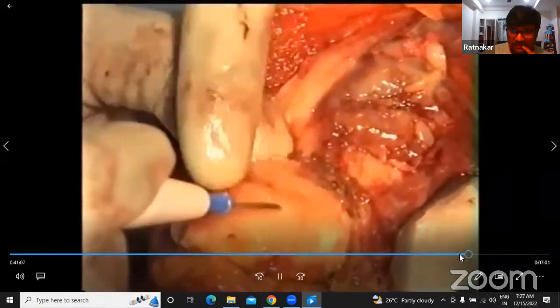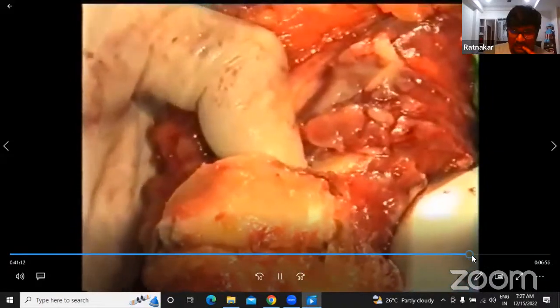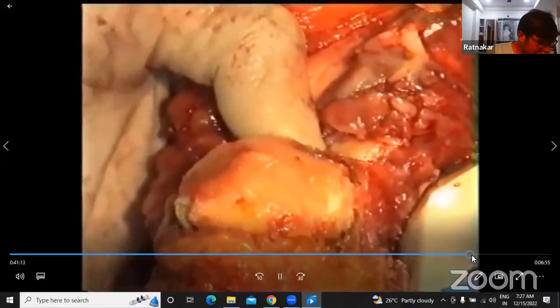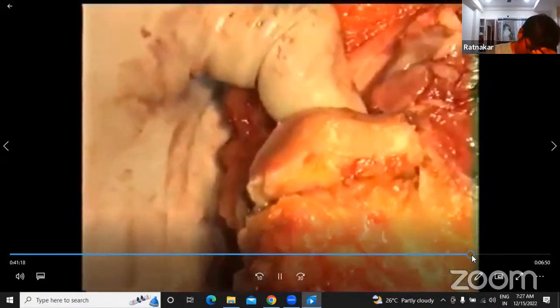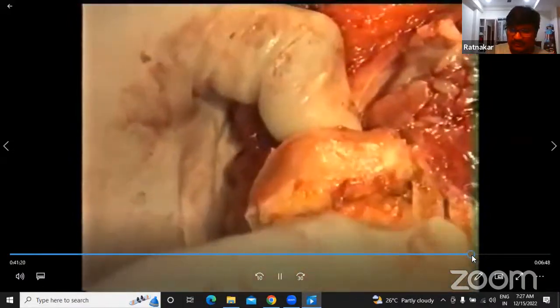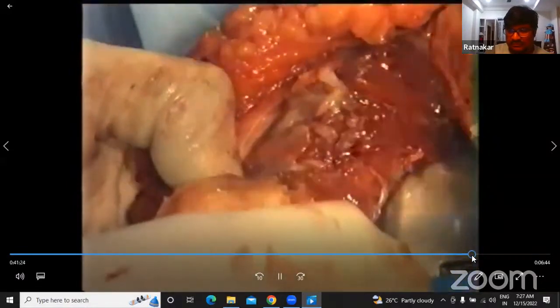Is very well preserved in this case. Now I will do a bit of lateral release. The lateral release should be done by inverting the patella like that, and then just 1 centimeter away from there.